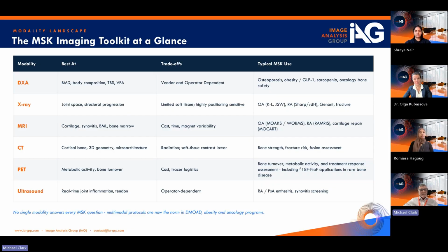So you have a lot of tools that you can use when doing an imaging trial. Many of them are required by the FDA or the EMA. Some of them you just want to get more information on the drug and the method of action and see if it's working, or for safety reasons.